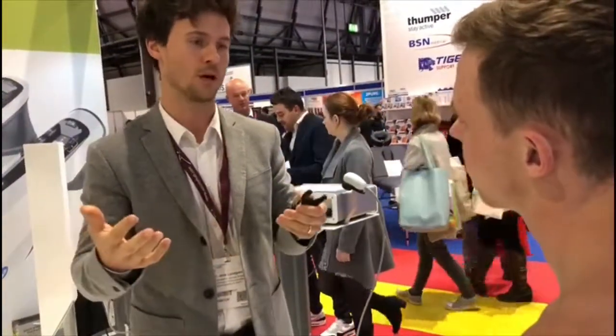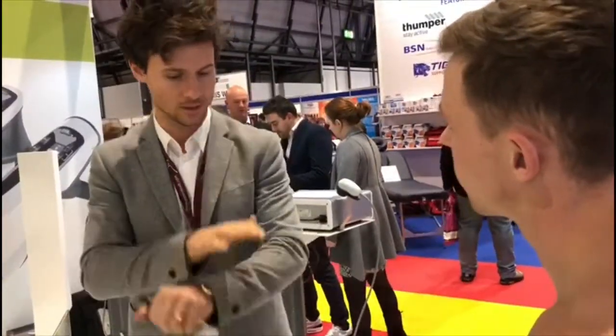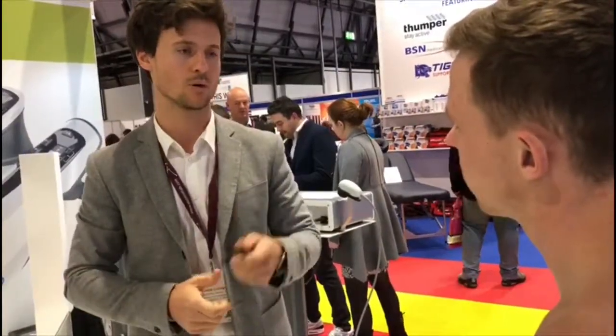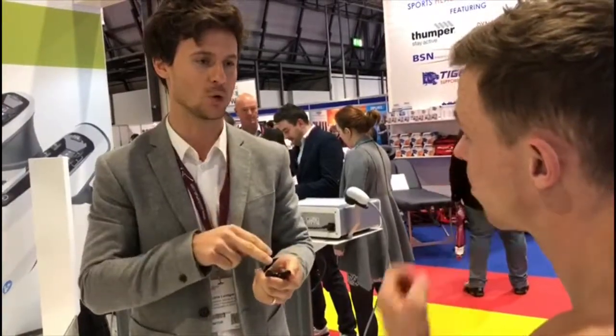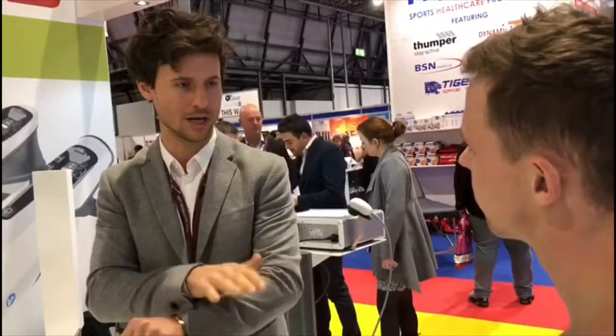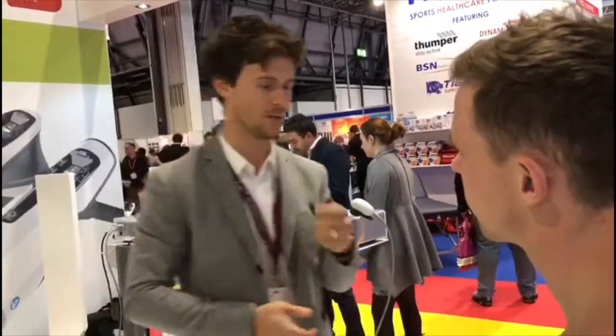This should be pain-free, almost. It's quite comfortable. I don't know if you've tried high-velocity manipulations where somebody's cracking, which could be a little bit painful. This is a lot more comfortable, and I would say it's inside the safety zone in all types. While if you're not experienced, high-velocity manipulations could actually be dangerous — but this would be perfectly safe.